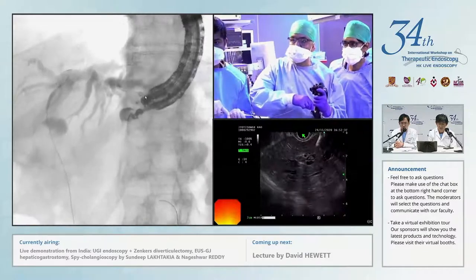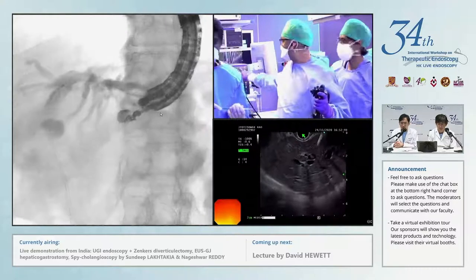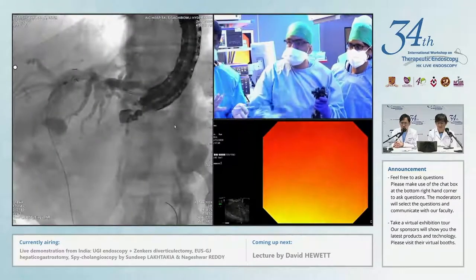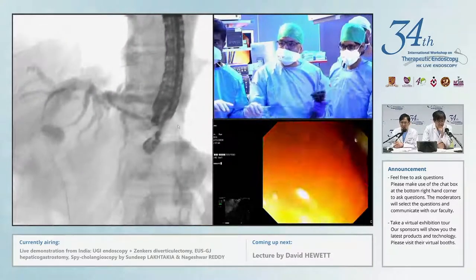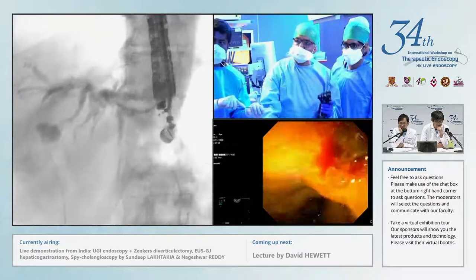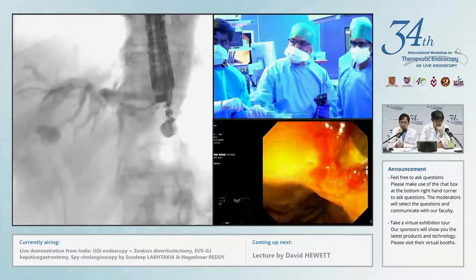In the stomach. Yes. So, yeah, we do the same too. But now we'll switch to the endoscopy mode. Are you going to deploy in the channel or what's your plan? Yes, I want to see it endoscopically myself. And so that's okay. Now I deploy. Release. I'm pulling back my scope. I like to see things under vision as well.